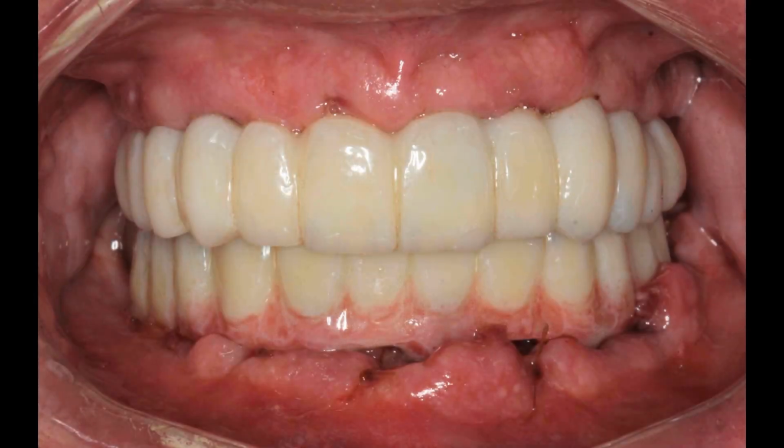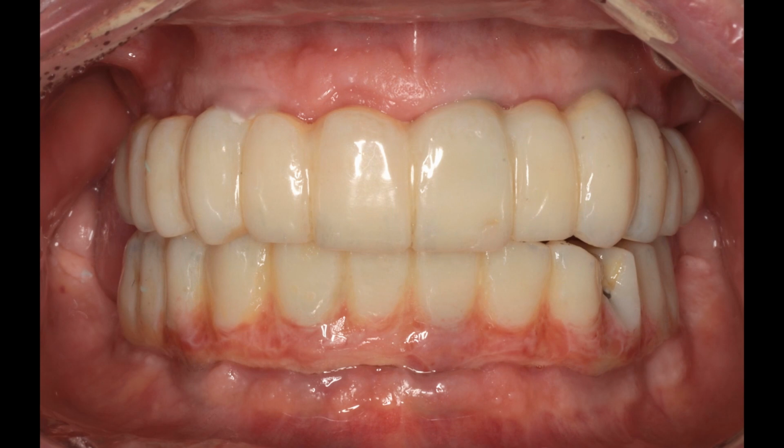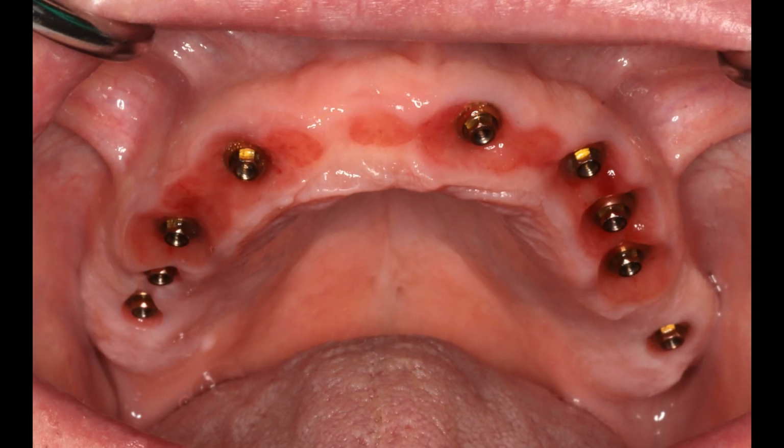The day of surgery, his temporaries and the tissues on that first day of surgery. And here he is 3 months later. The lips retracted soft tissue architecture, and again, just mesmerizing. I can't get over how amazing some of these cases, most of these cases, are.